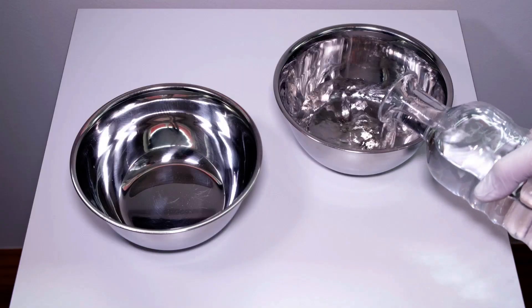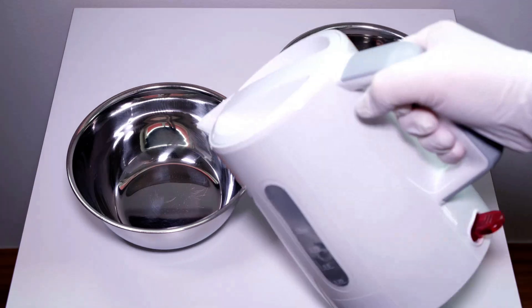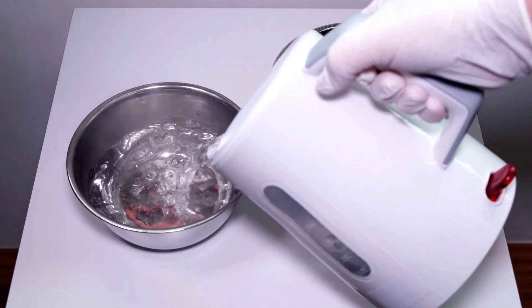Have the two small bowls ready. Fill one with very cold water. Boil some water in the kettle or saucepan and pour it into the second bowl.